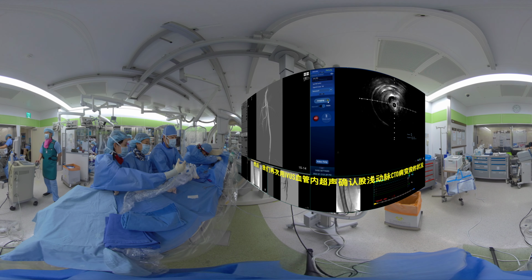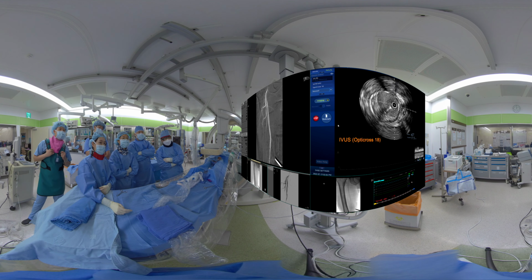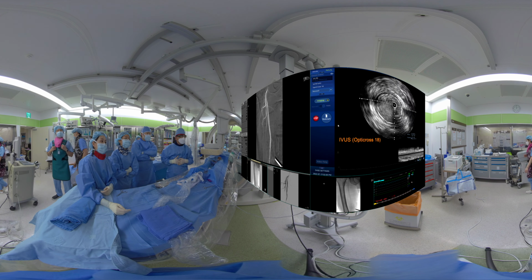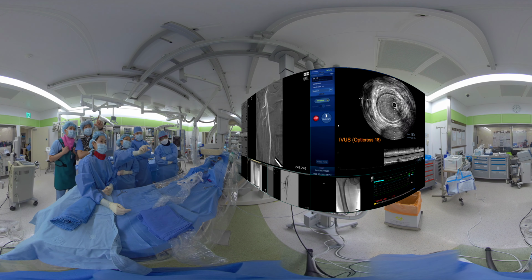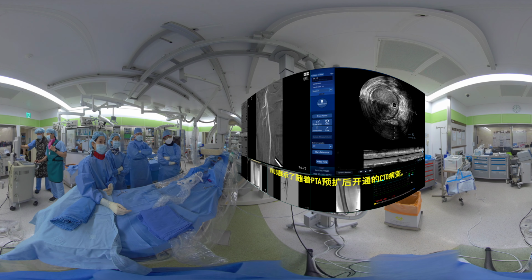And then we checked the SFA CTO lesions again with IVUS. IVUS showed the recanalized CTO lesions along the PTA site.